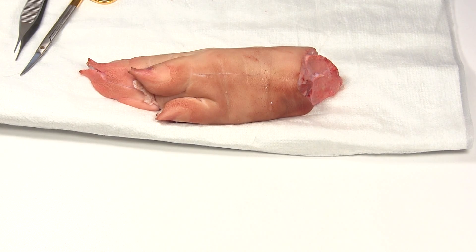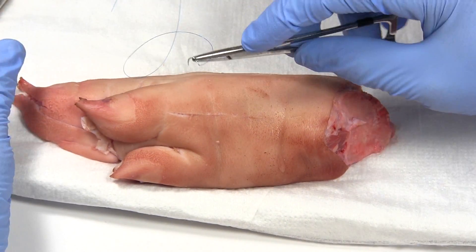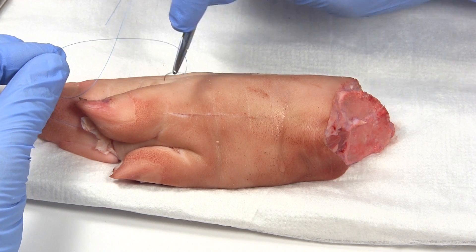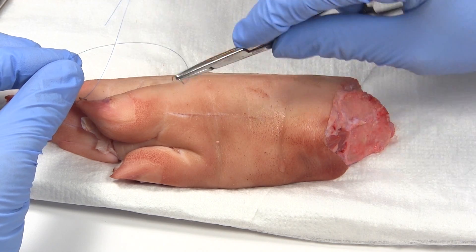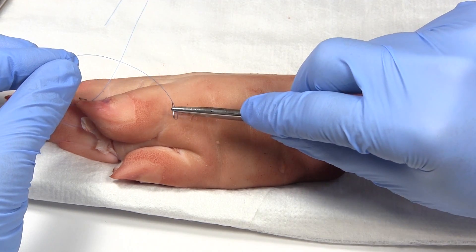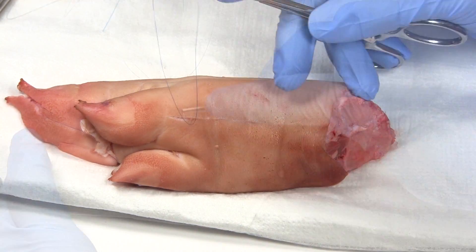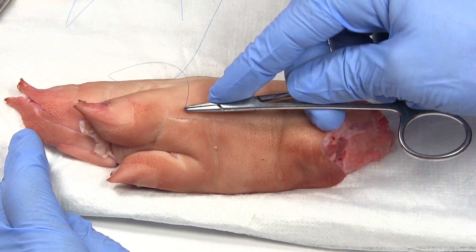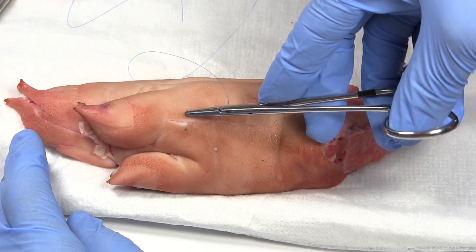For simple interrupted sutures, you start on one side of the wound. You want the needle to go in at 90 degrees — perpendicular to the skin edge. Then you just take your wrist and flip it around 90 degrees in a wrist flip motion, and it comes out the other side.